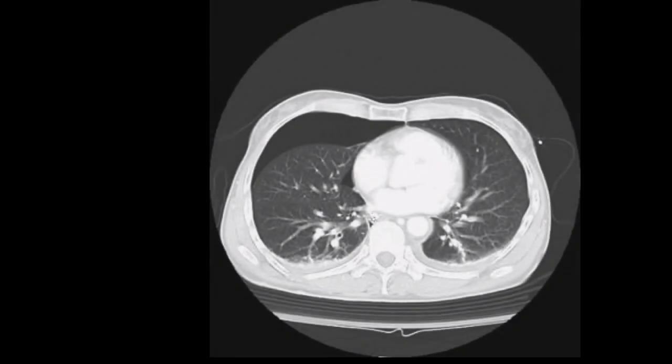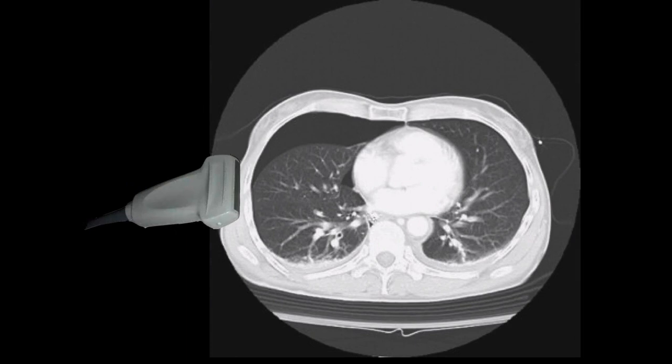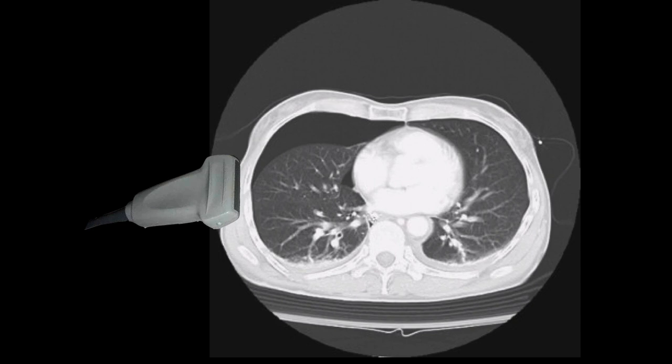This is what you're actually visualizing when you see a lung point on ultrasound. You're putting your linear transducer right at the border of the pneumothorax. So on one side you're seeing lung sliding, and on the other side you're seeing no lung sliding. If you see this, think pneumothorax.